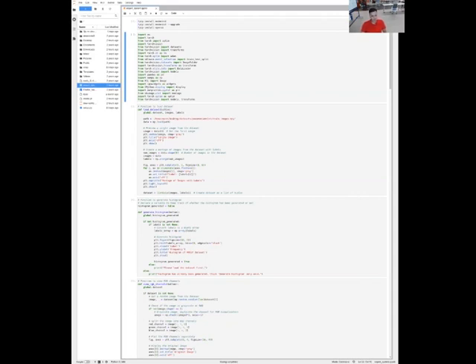The pneumonia subset consists of a total of 5,856 images. These images are divided into three sets: train set, validation set, and test set. For the distribution of images, the train set has 4,682 images, the validation set has 1,044 images, and the test set has 130 images.